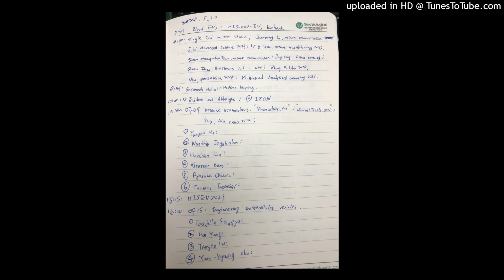When I then looked at the literature, we looked at the 20 most recent papers studying vesicle-associated microRNA in clinical studies. I think 1 in 5 did not report anything about blood collection handling, and the other ones were all completely different. And then you know something is really wrong in the basics.